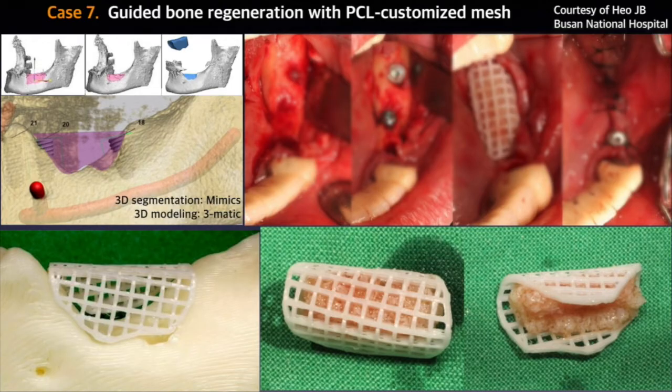Implant was installed and a PCL mesh was placed. The membrane was fixed with minimum gap and perfect fit. I anticipate that this membrane will also be used widely in the near future.